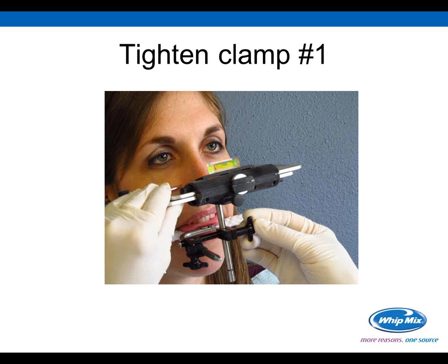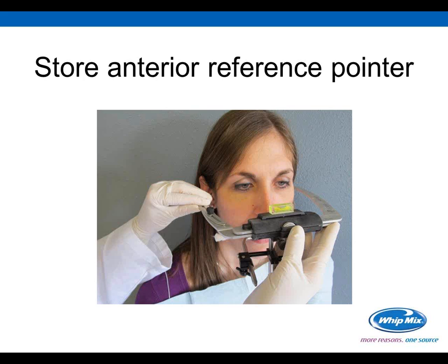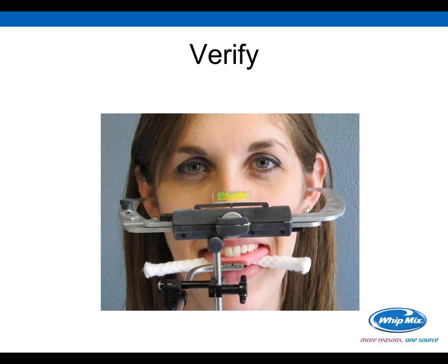Now that I have everything aligned properly, we're going to tighten clamp number 1. And actually, we're ready to store our anterior pointer. One of the reasons I point this out is because we want to lock it in place so that it doesn't swing forward and go back into the patient's face. That could startle them. And now I'm going to step back and verify my position. As you can see, I've got the ear bow level to the interpupillary line, and I'm right on the money with my bubble level.